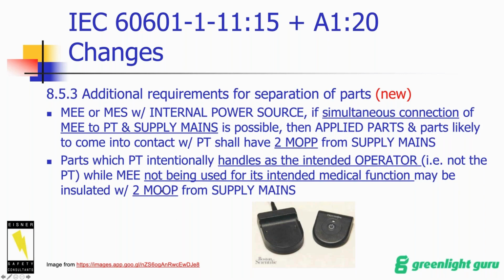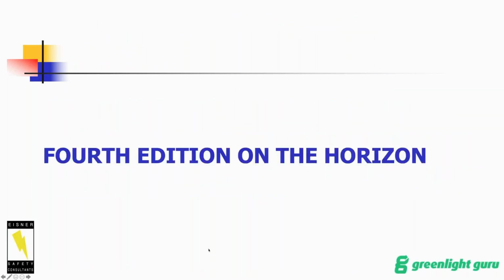Now you don't need patient protection, but operator protection, which is a level less stringent than patient. So it's a technicality, so the isolation requirement's less. My solution is if you use a 601 power supply, you have the highest level of protection, then you don't have to worry about operator because you're using patient protection. That's the way you get around it.